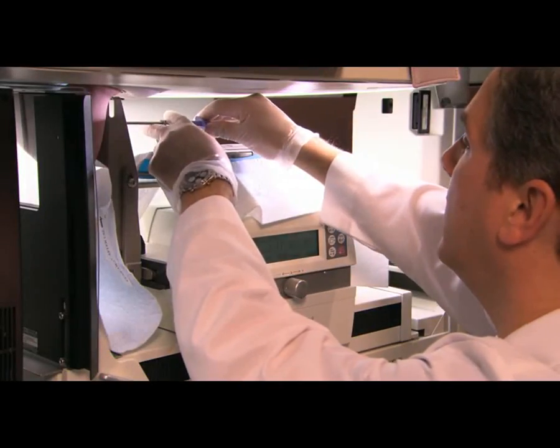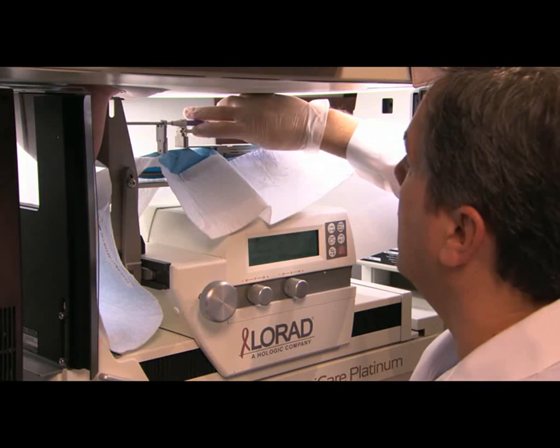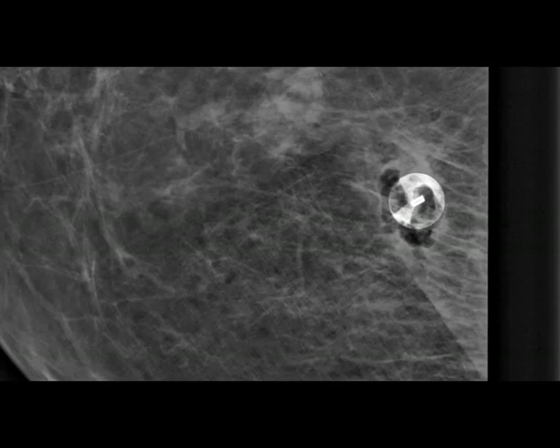Finally, a tiny marker is placed at the spot where they took the sample. This can be seen in future mammograms to show the location of this biopsy and to minimize the chance that this location would be biopsied again.